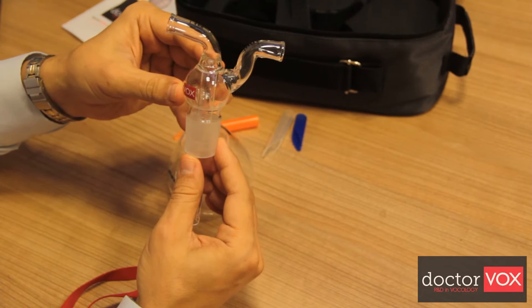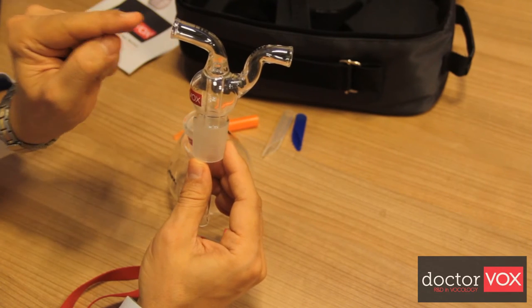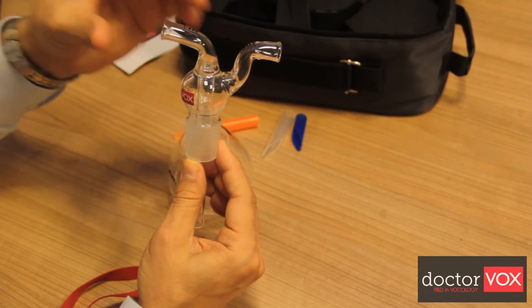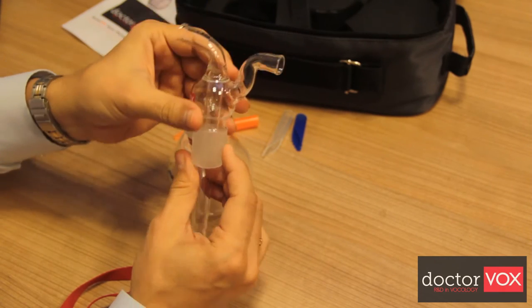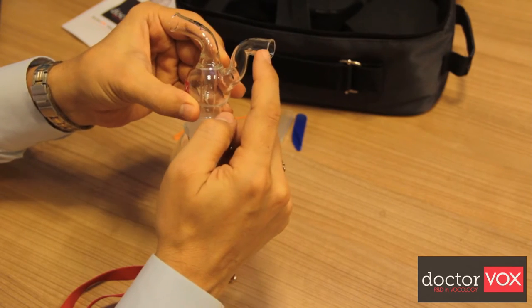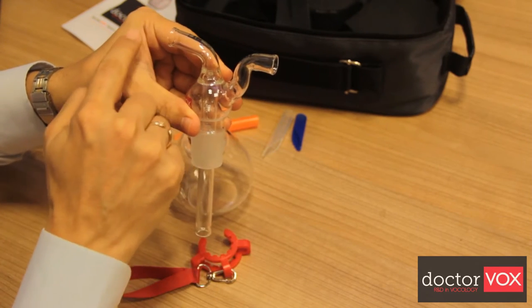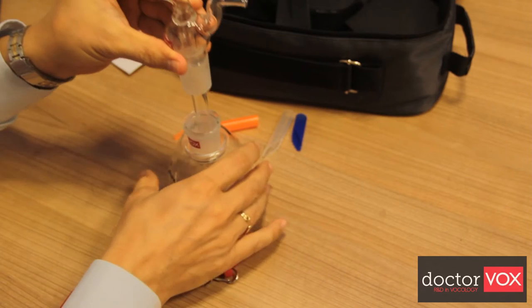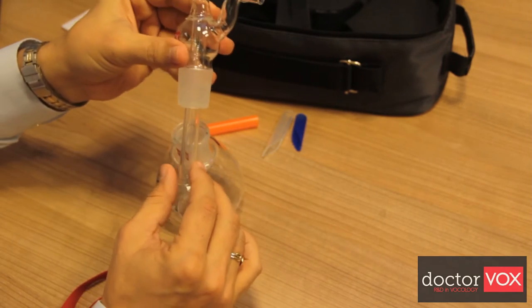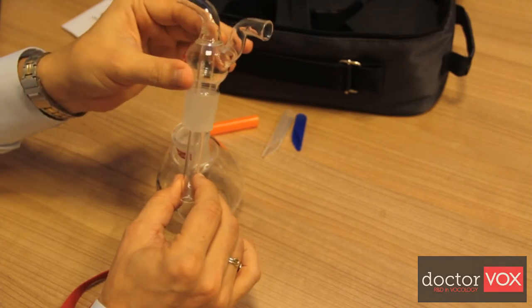During vocal exercise, the user blows air or voice through the inner tube and takes the advantages of Lexvoxing. During inhalation from the breathing outlet, air enters from the phonation inlet and passes through the water to be humidified. The humidified air directly affects the vocal fold mucosa.